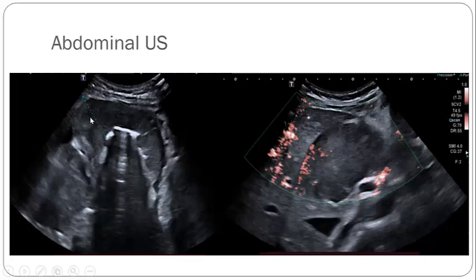This is malignant circulation. Then when we go up to the upper abdomen, this is the abdominal ultrasound. We found these lesions. We find here that the stomach has a markedly thickened wall, forming what we always describe as the pseudo-kidney shaped sign. This is the air inside the lumen, and this is the diffusely thickened wall. And here we found also epigastric amalgamated lymph nodes. So it gives us a strong clue that this patient might have lymphoma. And we recommend that the patient should take a biopsy, either an endoscopic biopsy from the stomach wall or a biopsy from the epigastric lymph nodes via CT biopsy.